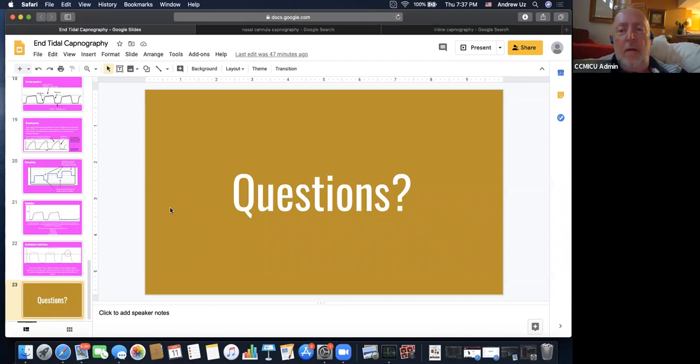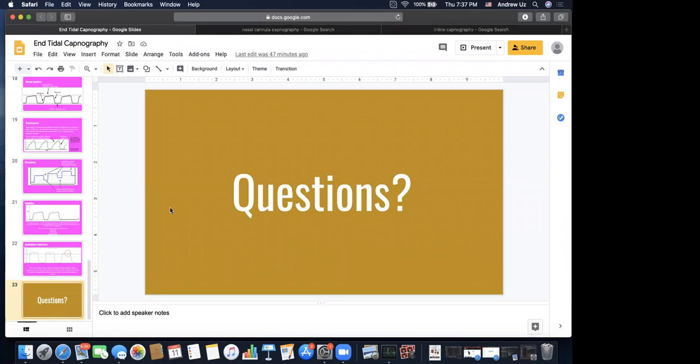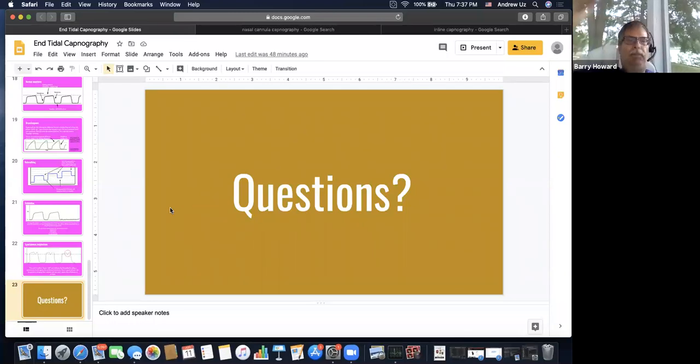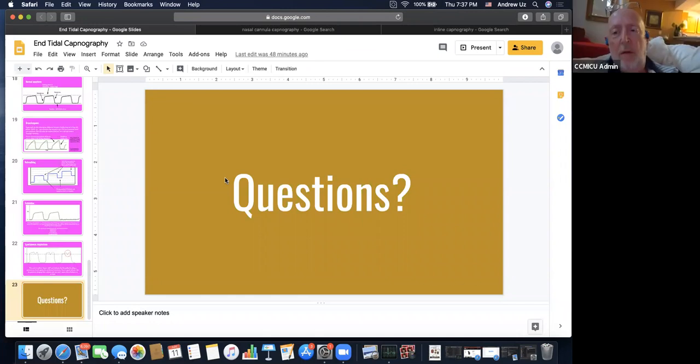I believe it is a skill in Maryland. I'm pretty sure. I attended a class in Ocean City on this several years ago, and when I came back, I remember we were talking about this, and that's when we started buying the end-tidal CO2. But the point is that if it's just BLS, we do not have the capacity to use the end-tidal CO2 because we don't have the monitor to accept it. That's the only limitation. Right. It is a BLS skill.